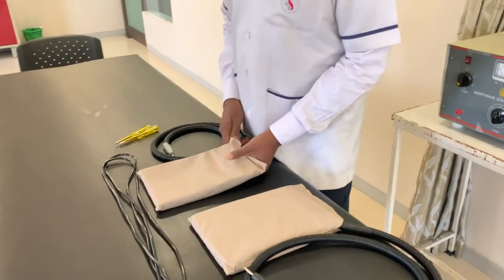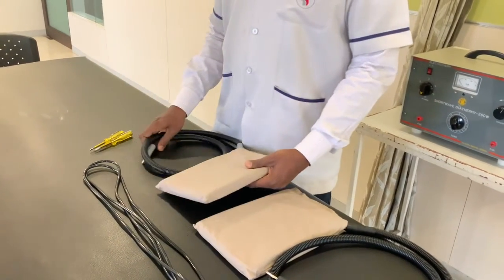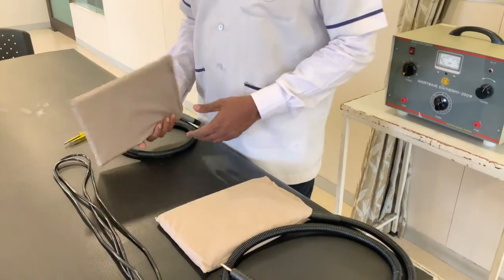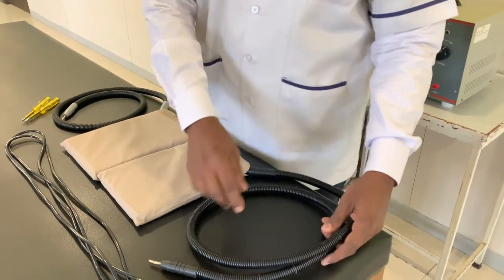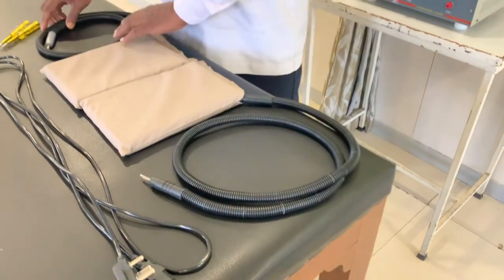In the capacitor field method, we have the electrodes. You can see 2 electrodes which are in good shape. There are no damages in the leads. The leads are also intact, both the leads.